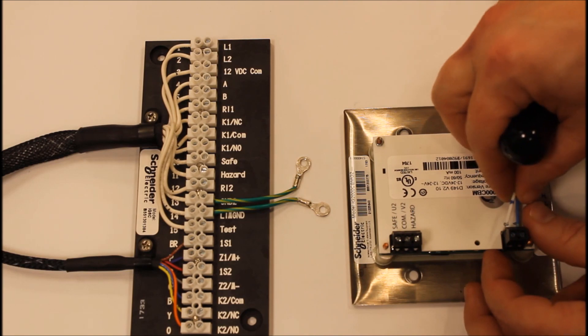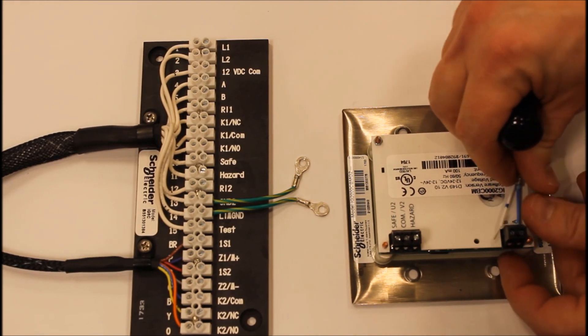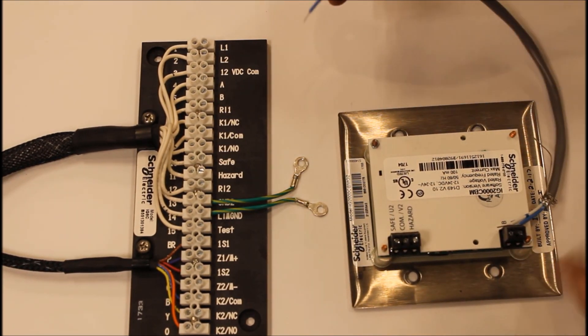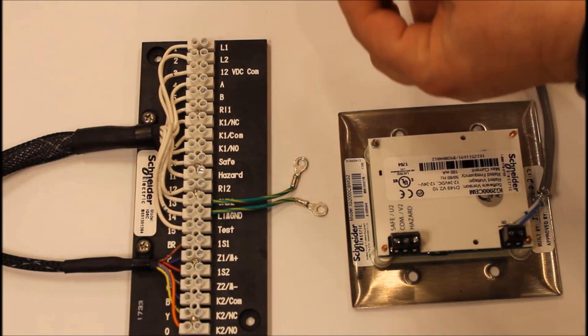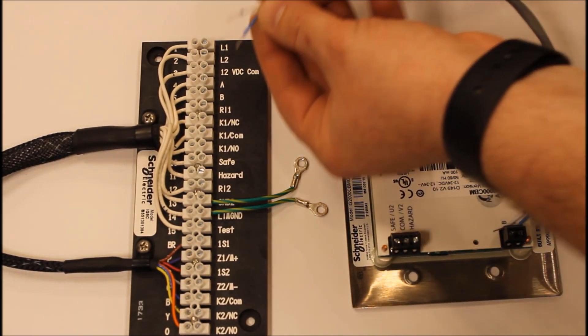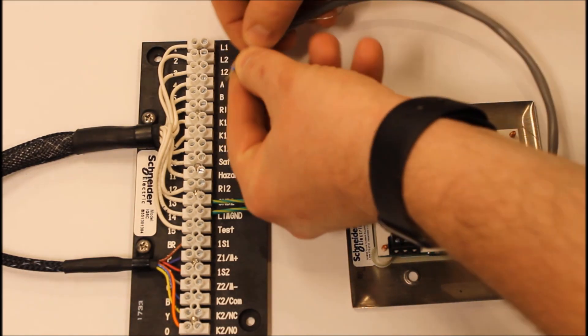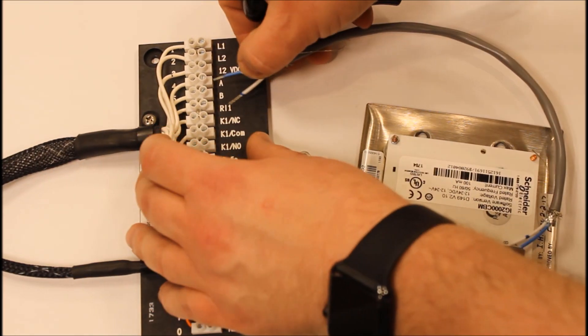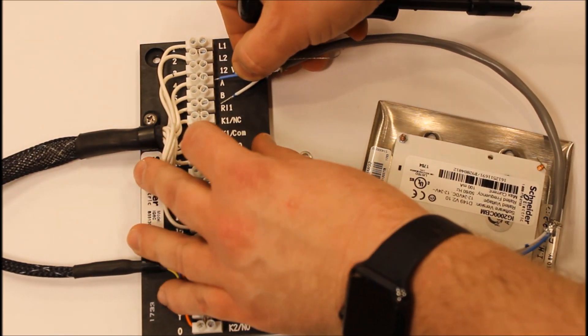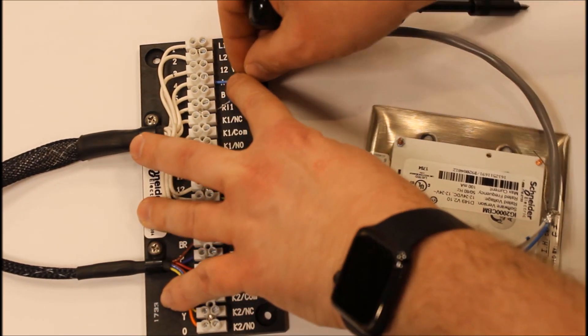We're going to start by using the terminals on the back of the indicator and connecting those A and B terminals to the A and B terminals on the connector plate itself.